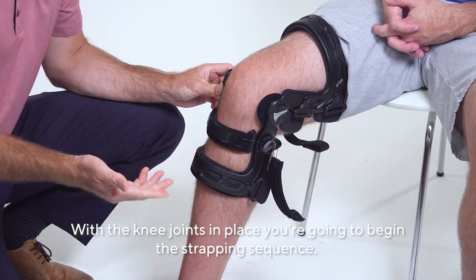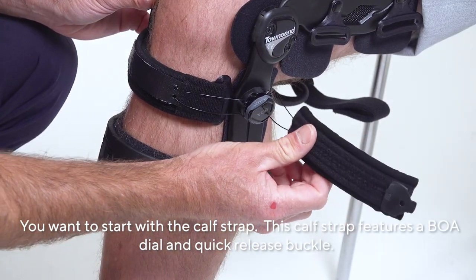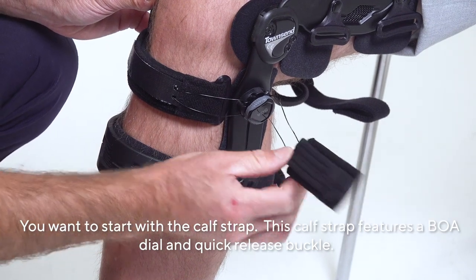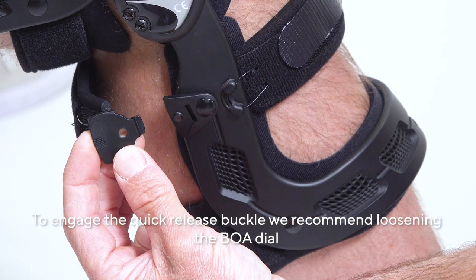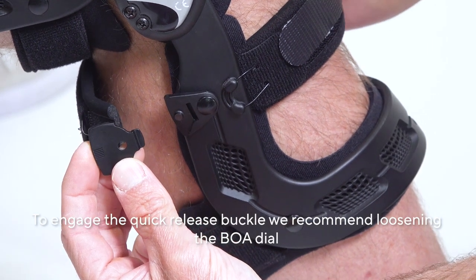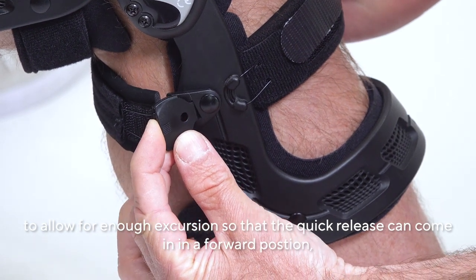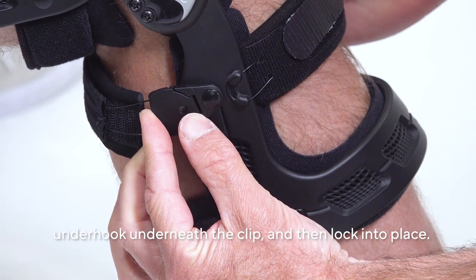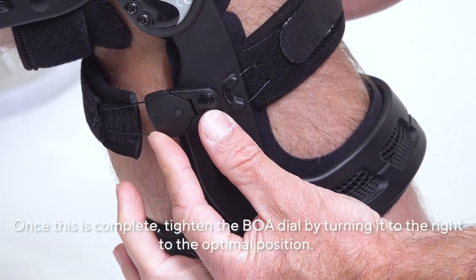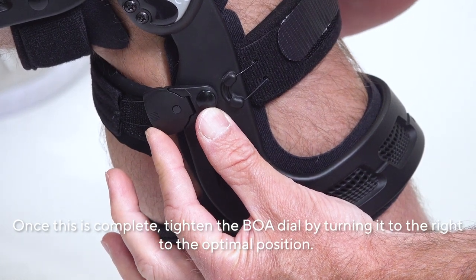With the knee joints in place, begin the strapping sequence. Start with the calf strap, which features a BOA dial and quick release buckle. To engage the quick release buckle, loosen the BOA dial to allow enough excursion so that the quick release can come in forward, underhook underneath the clip, and then lock into place. Once complete, tighten the BOA dial by turning it to the right to the optimal position.